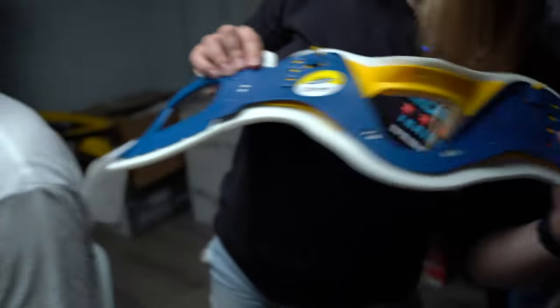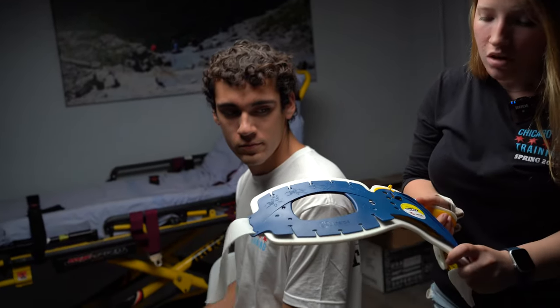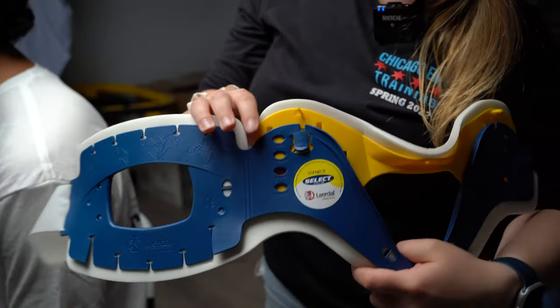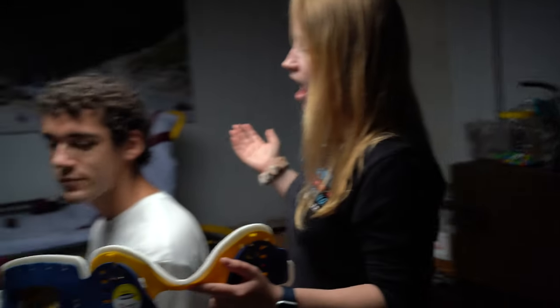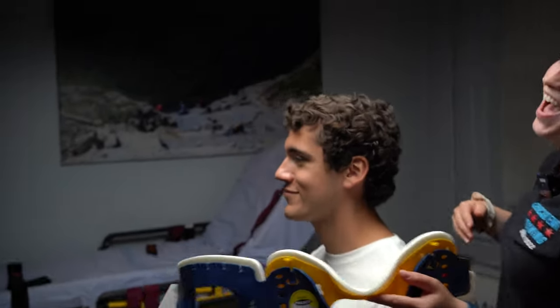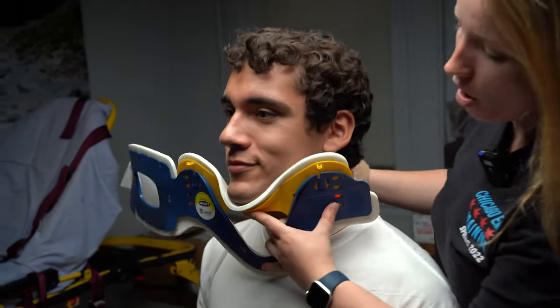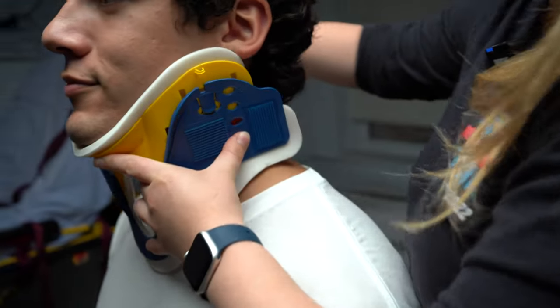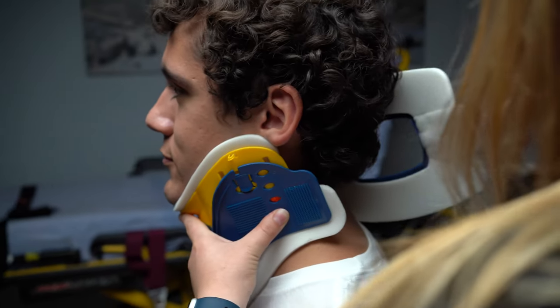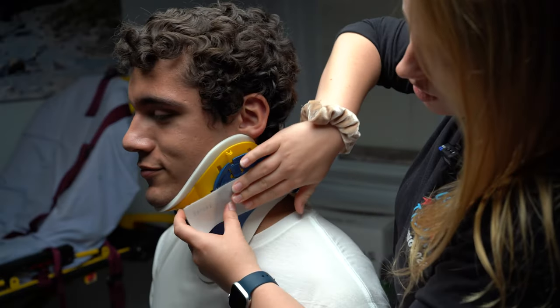So Diego is a short neck. I already had it unlocked, so I'm going to pull it so the red dot is in the short neck position, then lock it in place. Since my patient is already sitting, I can just come around — he shouldn't be moving his head at all if he's a real patient. I'm going to sit his chin on the chin rest, and with my left hand I'm pushing the collar in and pulling it around for a snug fit, then securing it with the Velcro.